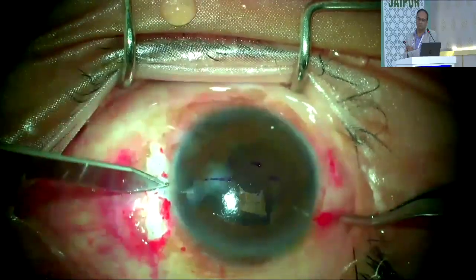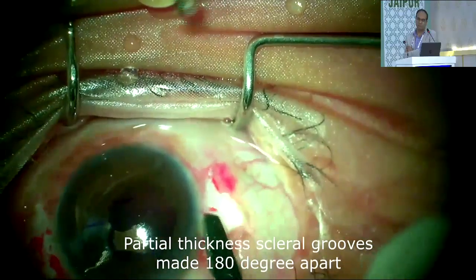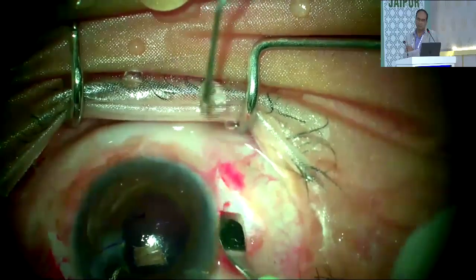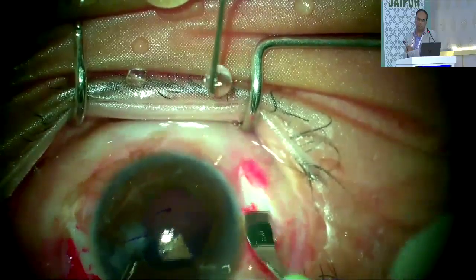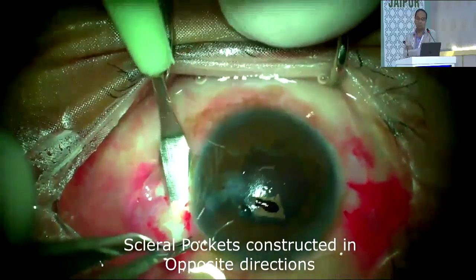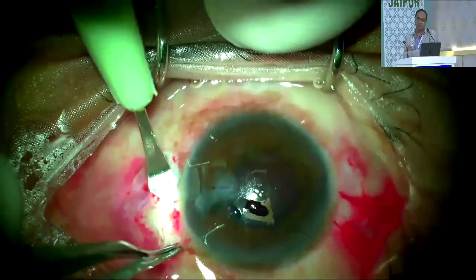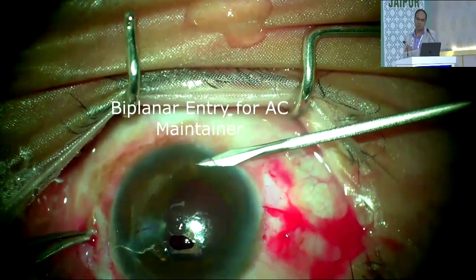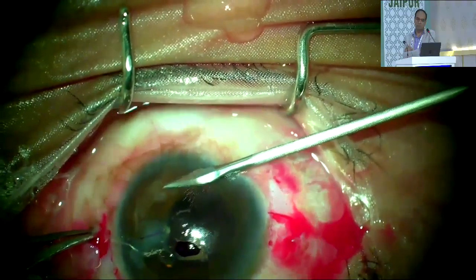Then partial thickness scleral grooves are created 180 degrees apart, and scleral pockets are performed in opposite directions to accommodate the haptics of the intraocular lens. And then a biplanar incision is made between the 6 and 7 o'clock positions to accommodate the AC maintainer.